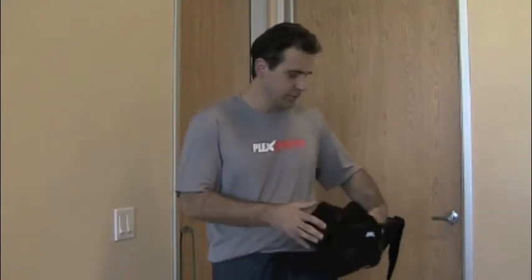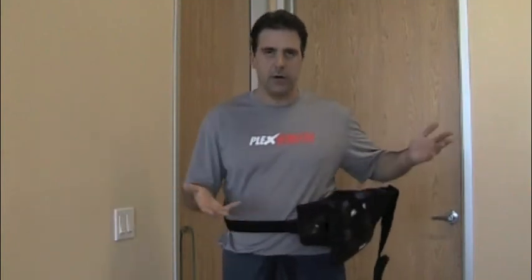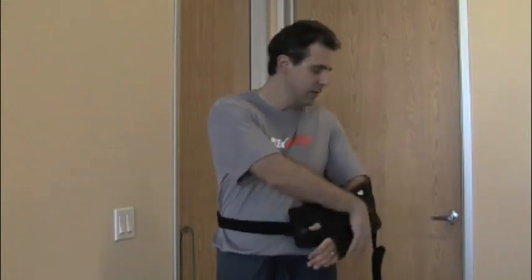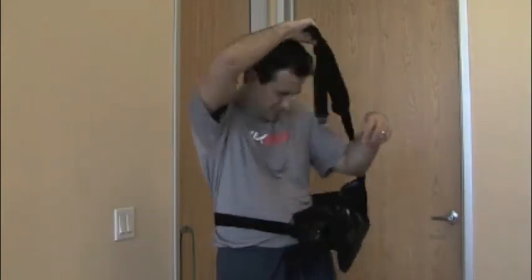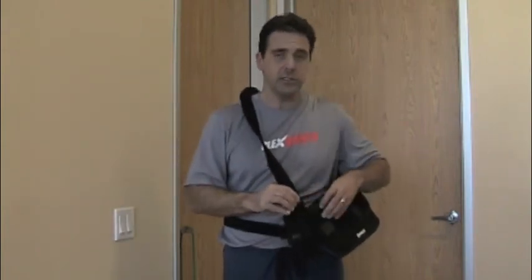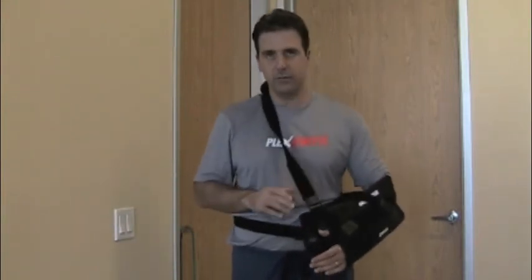They're pretty snug. As far as putting these on, you start by just putting on your abduction pillow first. Once it's sized, it should snap on pretty easily. Then this frees up the other arm, and you just slide in the sling itself. Obviously, you're going to need somebody to help you initially if you've had surgery before you put this sling on. There's a number of different parts, but once it's sized, it should fit you pretty well.